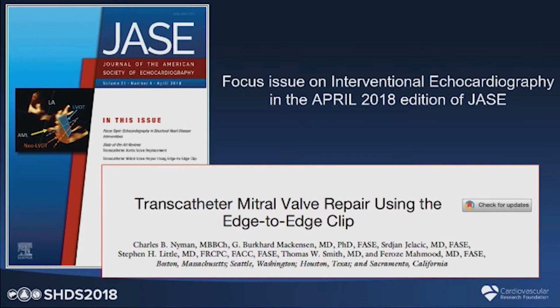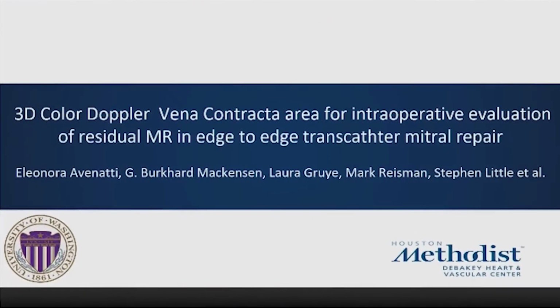We've summarized a lot of the echocardiographic imaging and guidance for the edge-to-edge repair of the mitral valve in this paper earlier this year in a focused image edition of JASE.